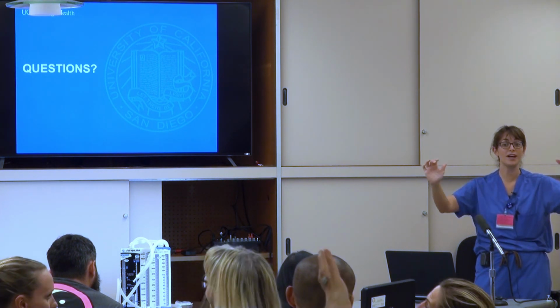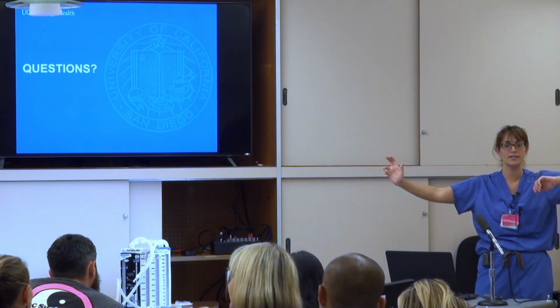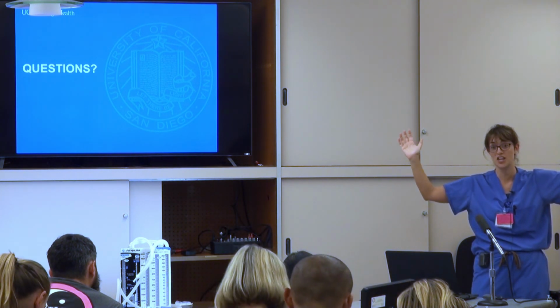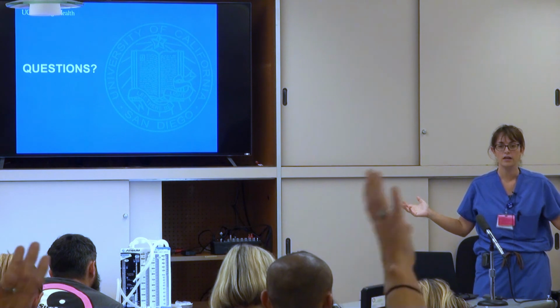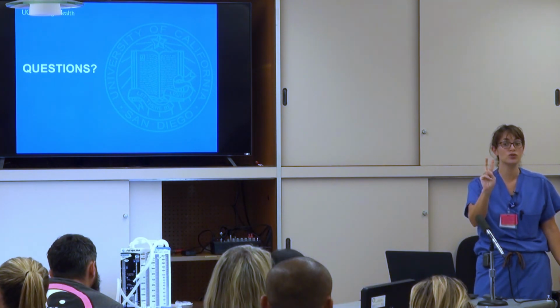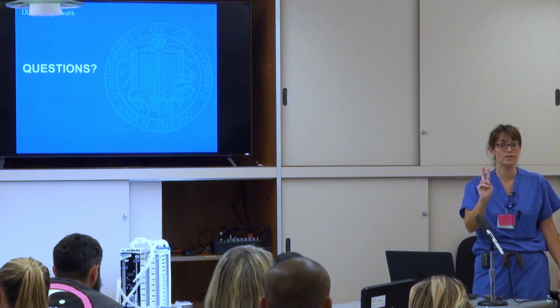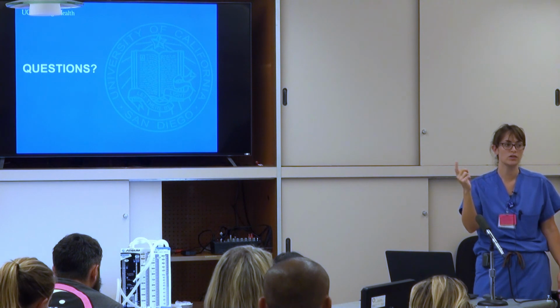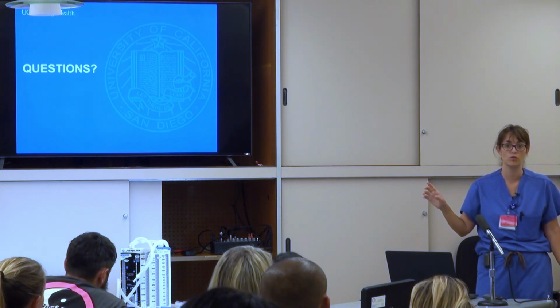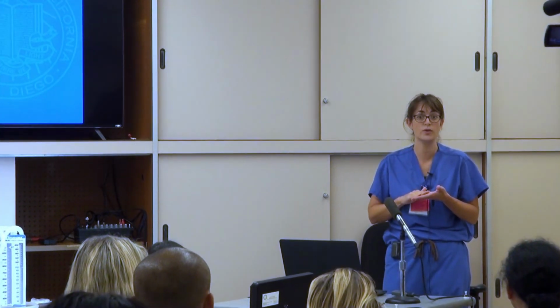So throw some gloves on, stretch it out, whatever retractors you have, because time is of the essence in that case. So while we're fumbling around and people are like, I need the finochietto, just hold it up. Throw some gloves on. In that setting, guys, throw 2 sets of gloves on. You'll see we only throw 1 set on. That's a terrible idea. Not only can you be cut, but the ribs crack, and there's a lot of potential for things to be torn and cause you injury. So just be very careful when you're assisting. But it's okay to do that.